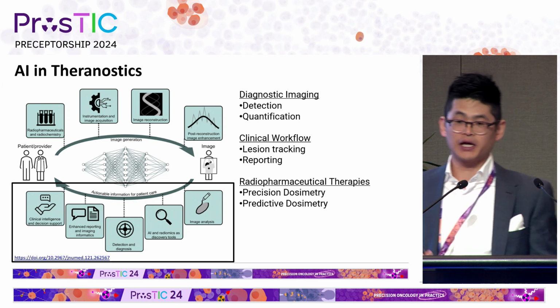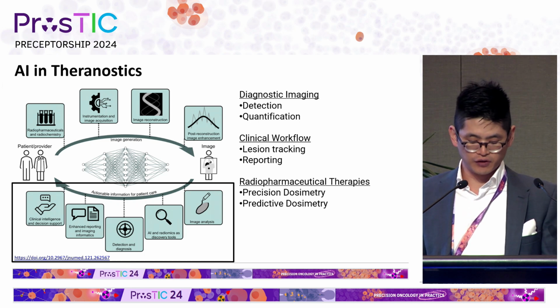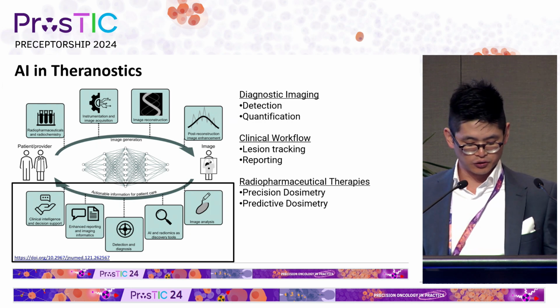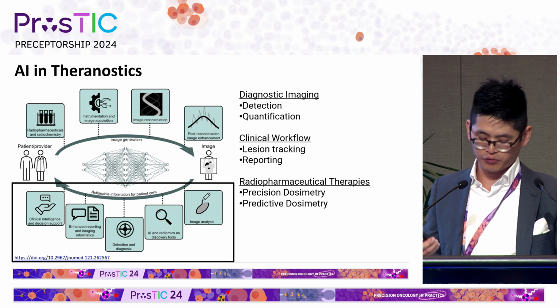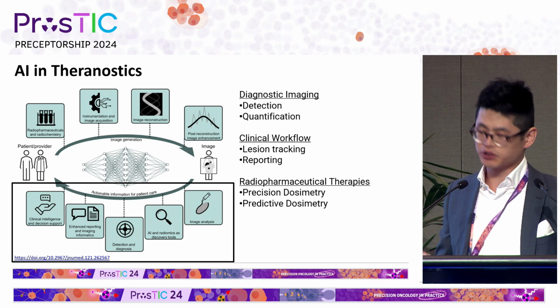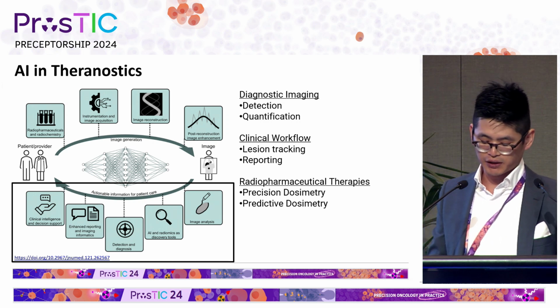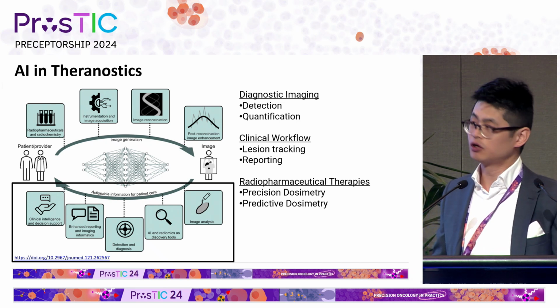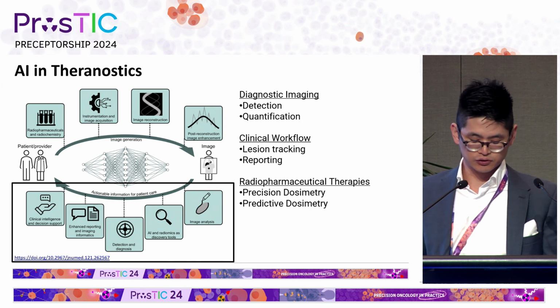PET is still inherently a semi-quantitative study type, and standardization of image generation is crucial, but beyond the scope for this talk. And so to really make it quantitative, we really do have to do that standardization. But today I want to focus on those image-to-patient applications. And I'll be breaking down into just basic steps and things like detection, quantification, lesion tracking, and reporting, and briefly touch on dosimetry.